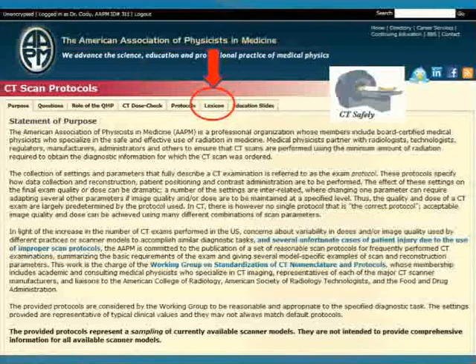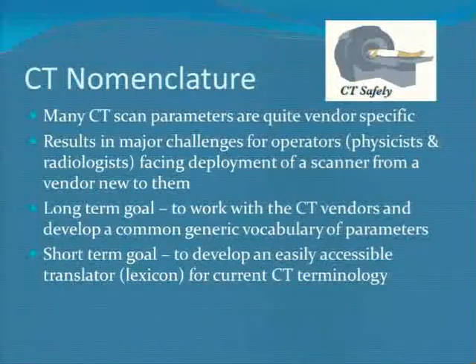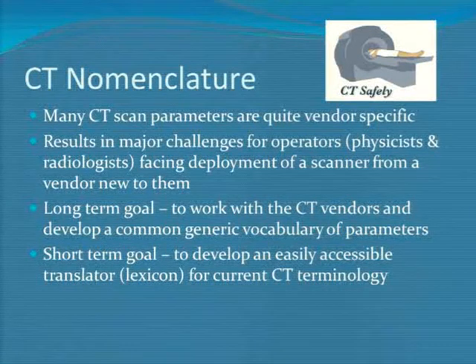So the next little tab here says lexicon. And this is what we've done as a stepping stone towards the nomenclature project, where we're trying to get all the vendors to agree on what one single term to use. This is sort of in place of that. This is basically a translator. And so we're all aware of what a struggle this is, in technologist training and understanding. So long term, we want to get some generic terms figured out.